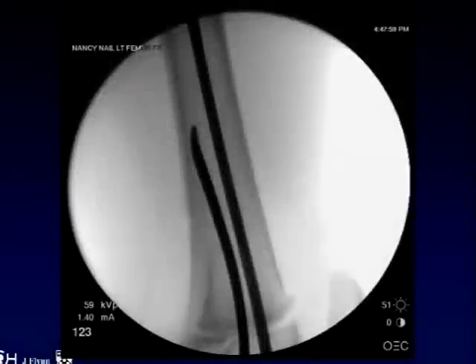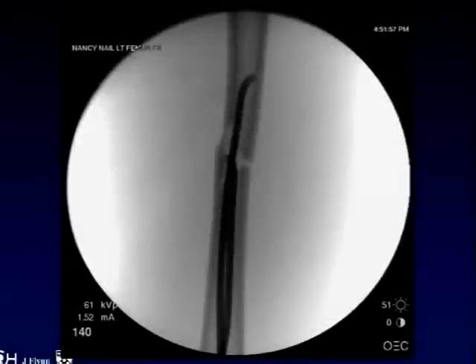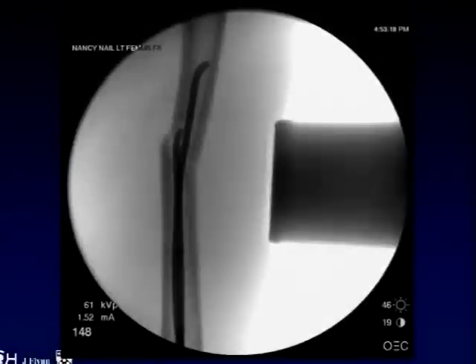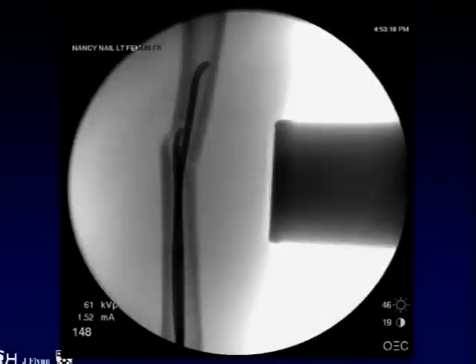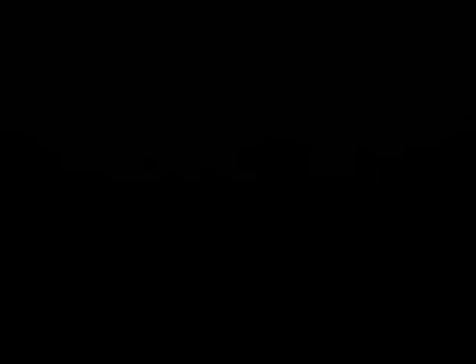Here we've checked a lateral view to make sure that we're in good position with that nail, and we bring it right up to the fracture site. Then carefully bringing the second nail across to be certain that you don't bang into a cortex or knock off an occult butterfly fragment. We've used a little external pressure with a large mallet to align the fracture, and the second nail is passed into the proximal fragment without difficulty.